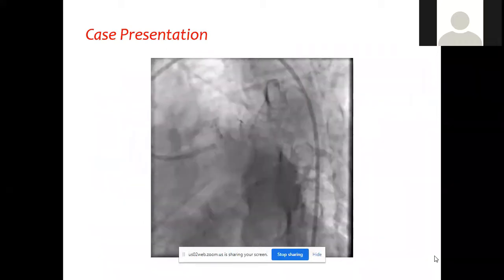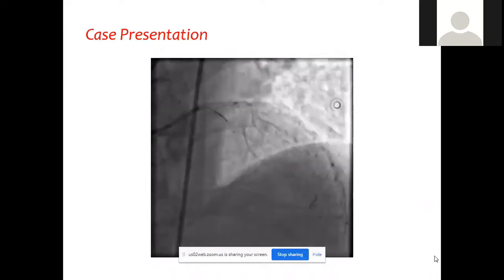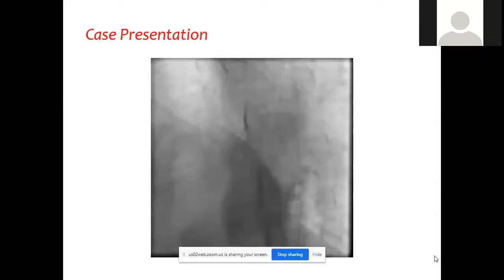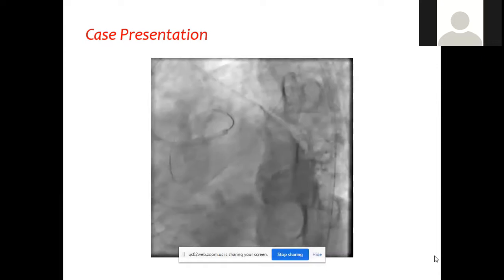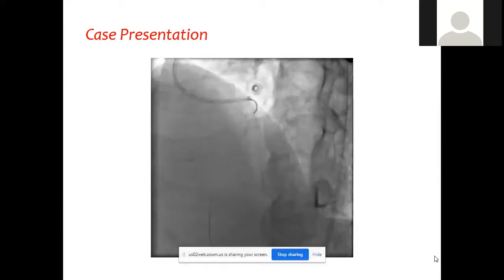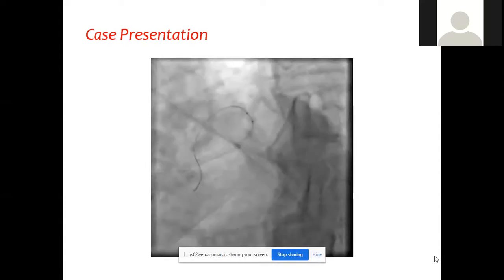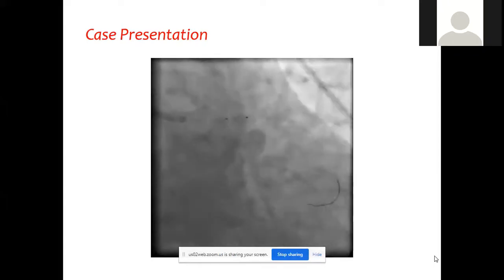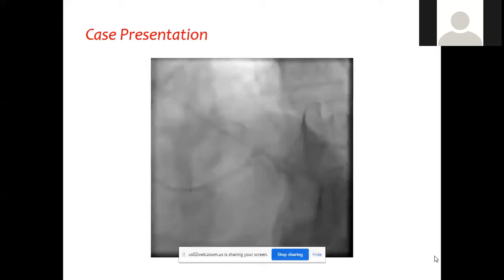This is the coronary angiography of the patient. As you see here, we started to cross first with a PT2 wire that was not able to cross. Then we crossed with a Gaia Second wire directly to the LAD distal vascular bed. Then we tried with a second Gaia wire to the diagonal. This second Gaia tried to go through the first stent to the second stent. Then it failed. Then we went with a POT with balloon dilation of the old stent, trying to find the track. We opened some of the struts at the bifurcation of the stent with a diagonal stent.